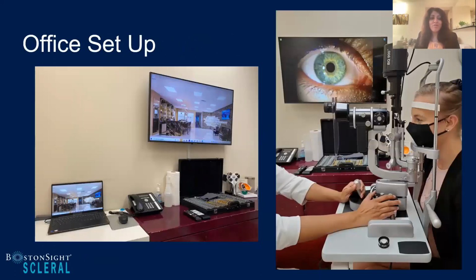I'm going to show you what our office setup looks like. We have here the main laptop computer that we use, and then we are able to project everything onto the big screen. And looking at the screen this way, when we're sitting with a patient, you have the camera attached here and then the big screen there. The primary reason for having that screen, one makes it really easy when I am taking photos. I can look over and see, am I in focus? Am I getting the image that I want? And I can quickly make adjustments and take images that way.